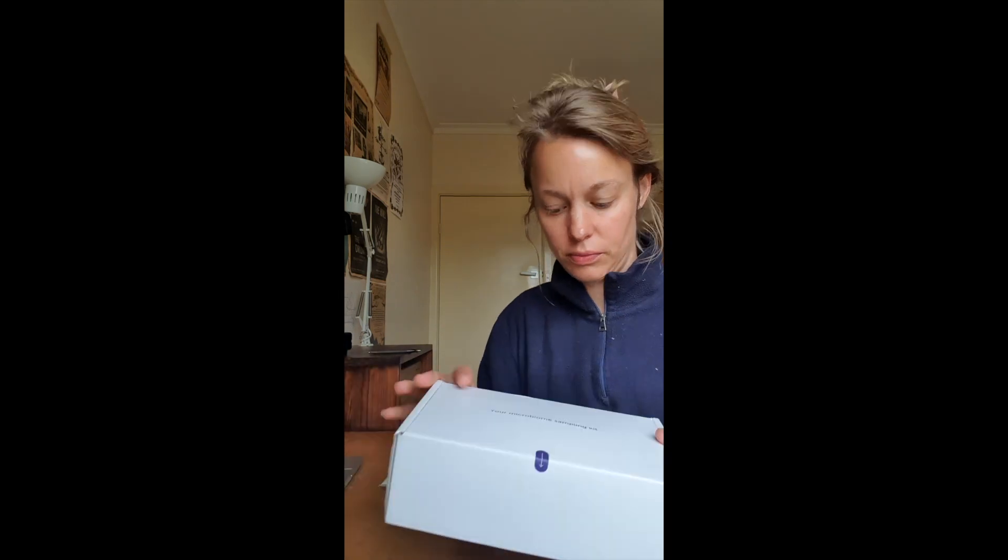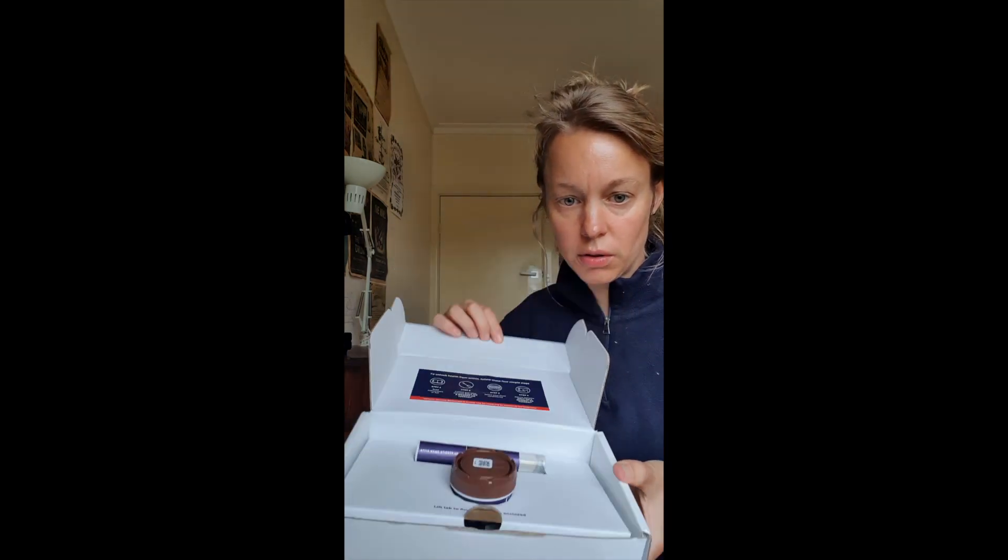So you've received your macrobic kit. Remember, you can only take this test on a Monday or a Tuesday. So if it's any other day, just stop now.